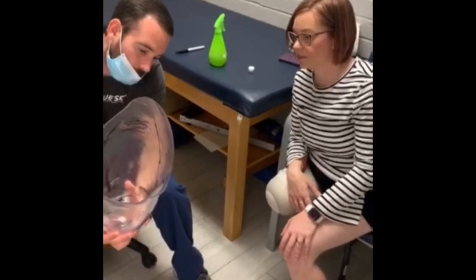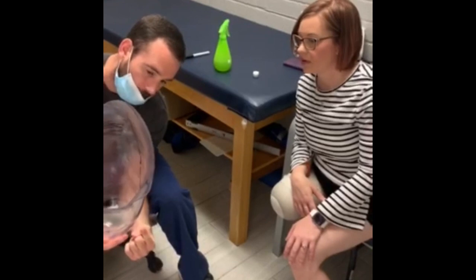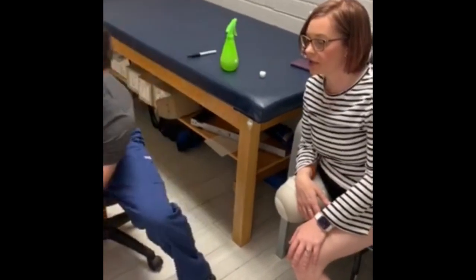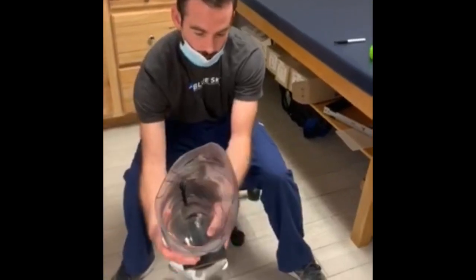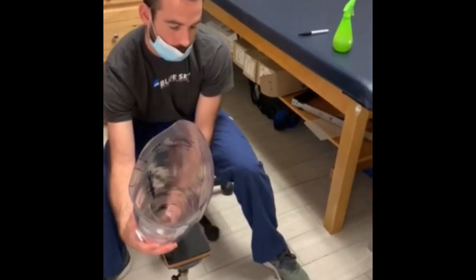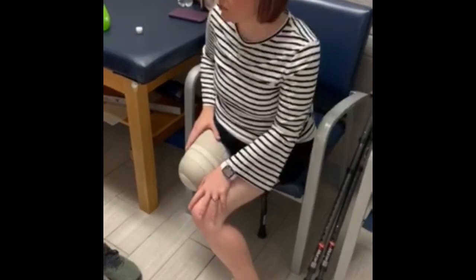Okay. So having that hockey puck in that knee right now is going to be back here, because if I put it here, I'm not going to be walking straight. Yeah, that leg will be sticking off like that. So then I have to move it more like that to get it fully underneath you. So what can I do to help that? Keep stretching. Just keep stretching, keep doing that. Okay.